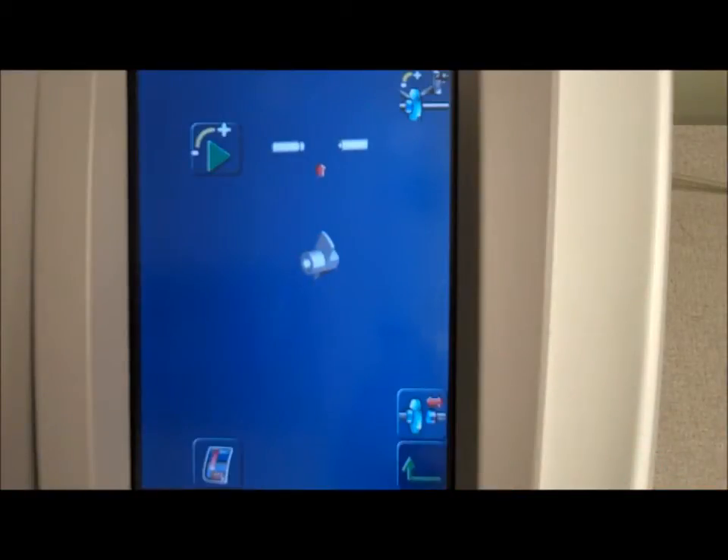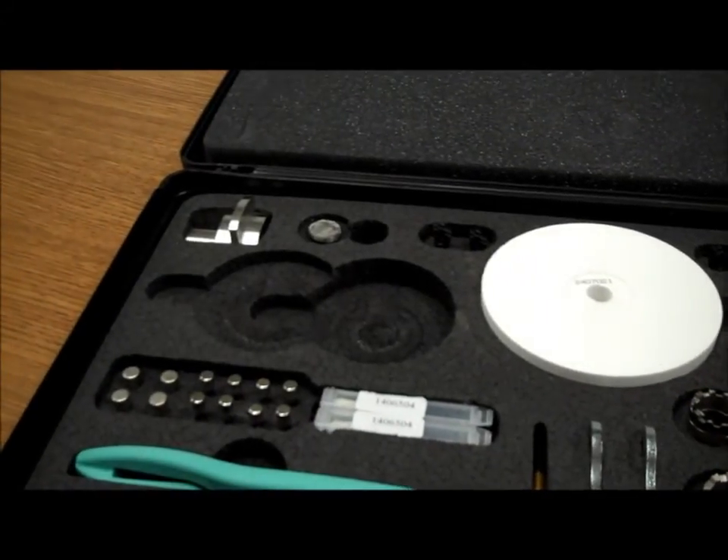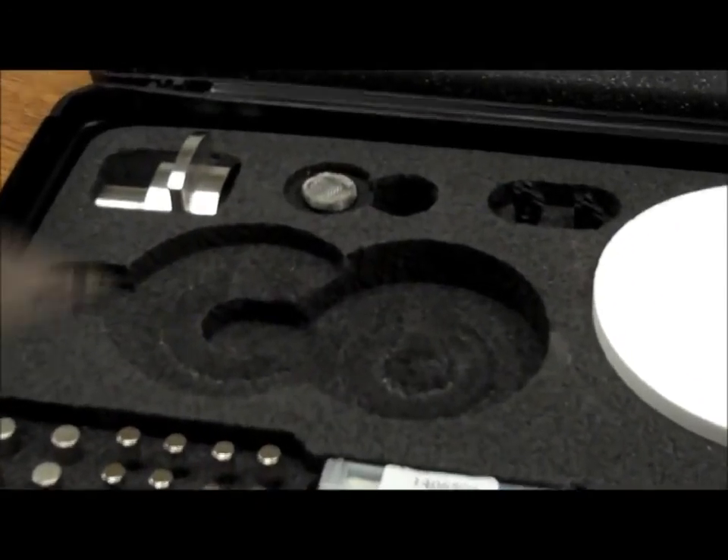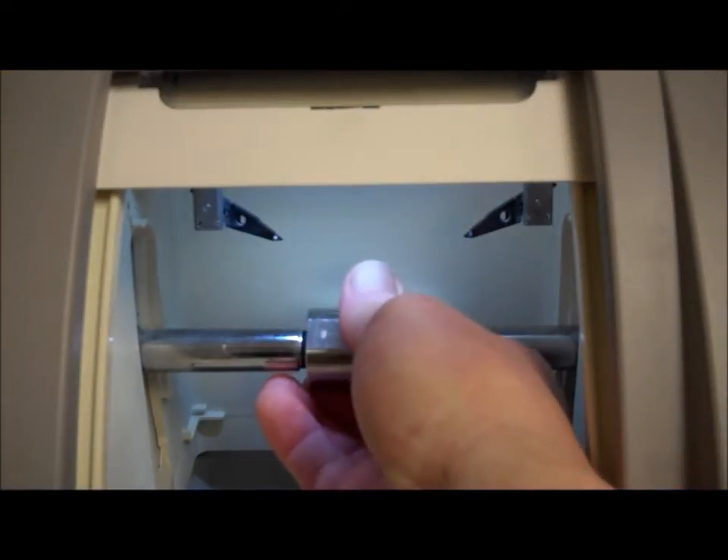At this point, you will need the calibration tool, located in the top left-hand corner of your accessories kit. Carefully remove the tool and firmly place the calibration tool on the left-hand side of the clamping shaft.